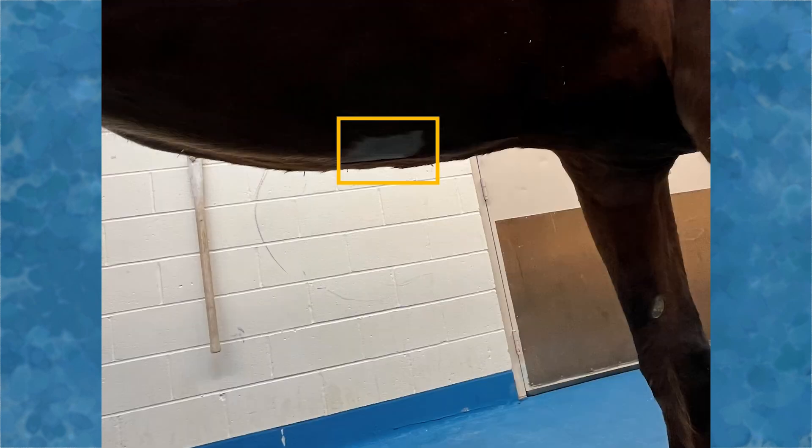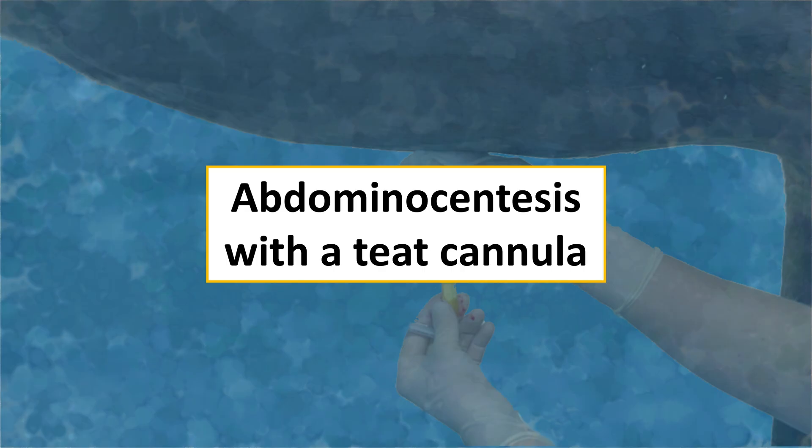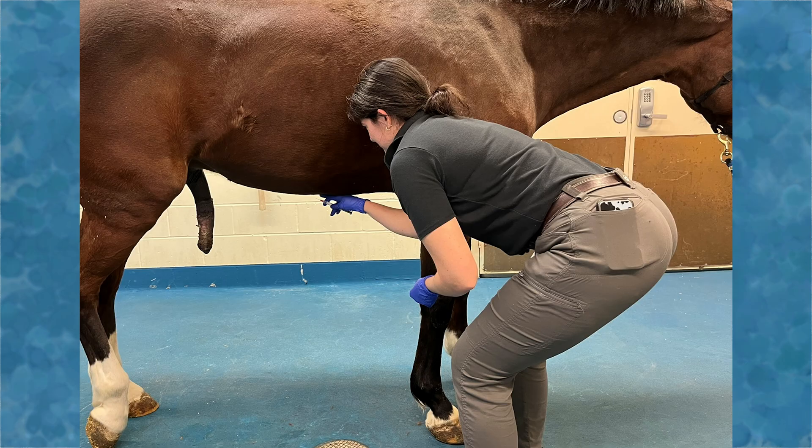In this area, we will clip a 10 centimeter by 10 centimeter square and aseptically prepare it. When performing abdominocentesis, it is important to stand in a safe location. Note that the veterinarian is near the horse's shoulder with her head and shoulders raised, as some horses may kick forward with a hind limb. It may be necessary to squat while obtaining the sample, but kneeling or positioning yourself near the hind legs is strongly discouraged.